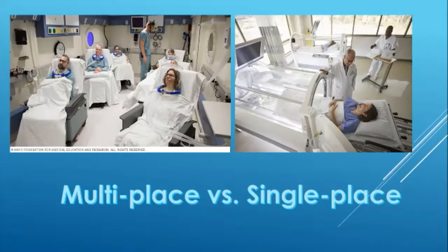The room itself is pressurized with room air. So this guy here, he's not being affected by the high oxygen. He's going around making sure everybody's mask is working right, checking their vitals and stuff like that. But he's not being affected by the oxygen because the room itself is pressurized with room air. But these people are actually getting some oxygen. See, she's got her oxygen tubing. Everybody has an oxygen hood on. So the ones who have oxygen on are now benefiting from the high oxygen content.